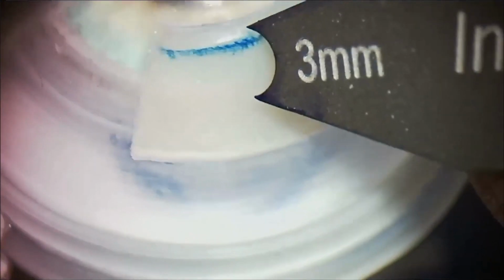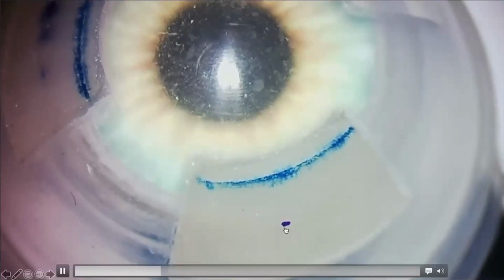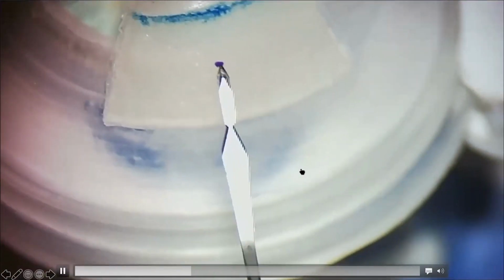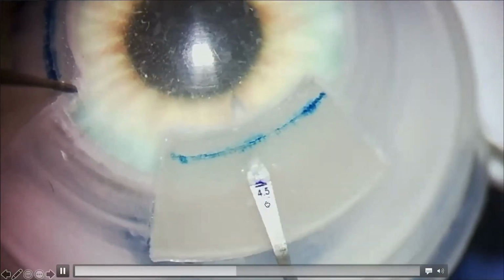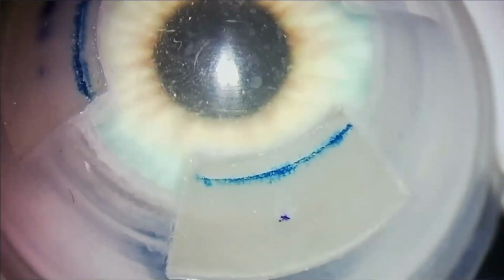It's nice because there is some rotation of the eye here, which is what you will do with the actual human eye during surgery. You're going to mark, again, about 3 millimeters posterior to where you would think the limbus is. And I think this is the most important part, and this is the step that you have to practice. Again, making that needle track into the anterior chamber. Again, you want that wider entry in the sclera. It's going to be a more narrow track into the eye.